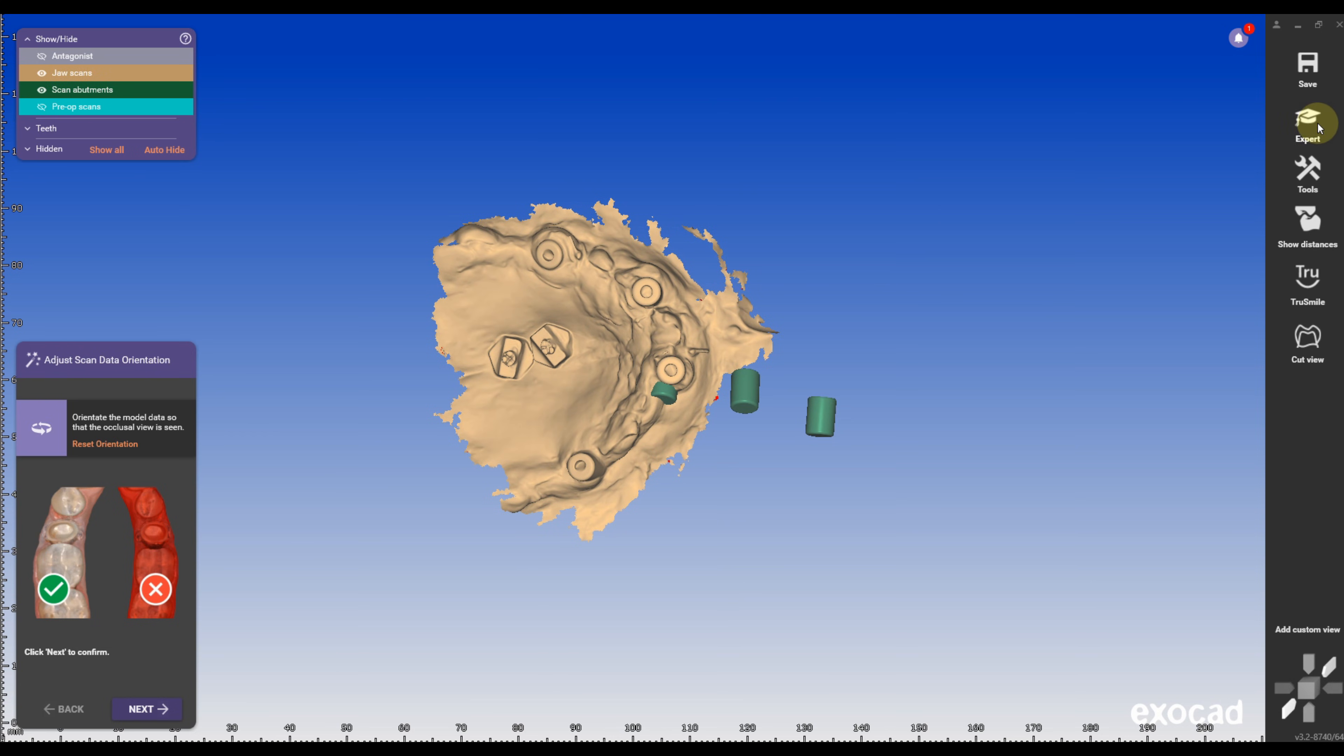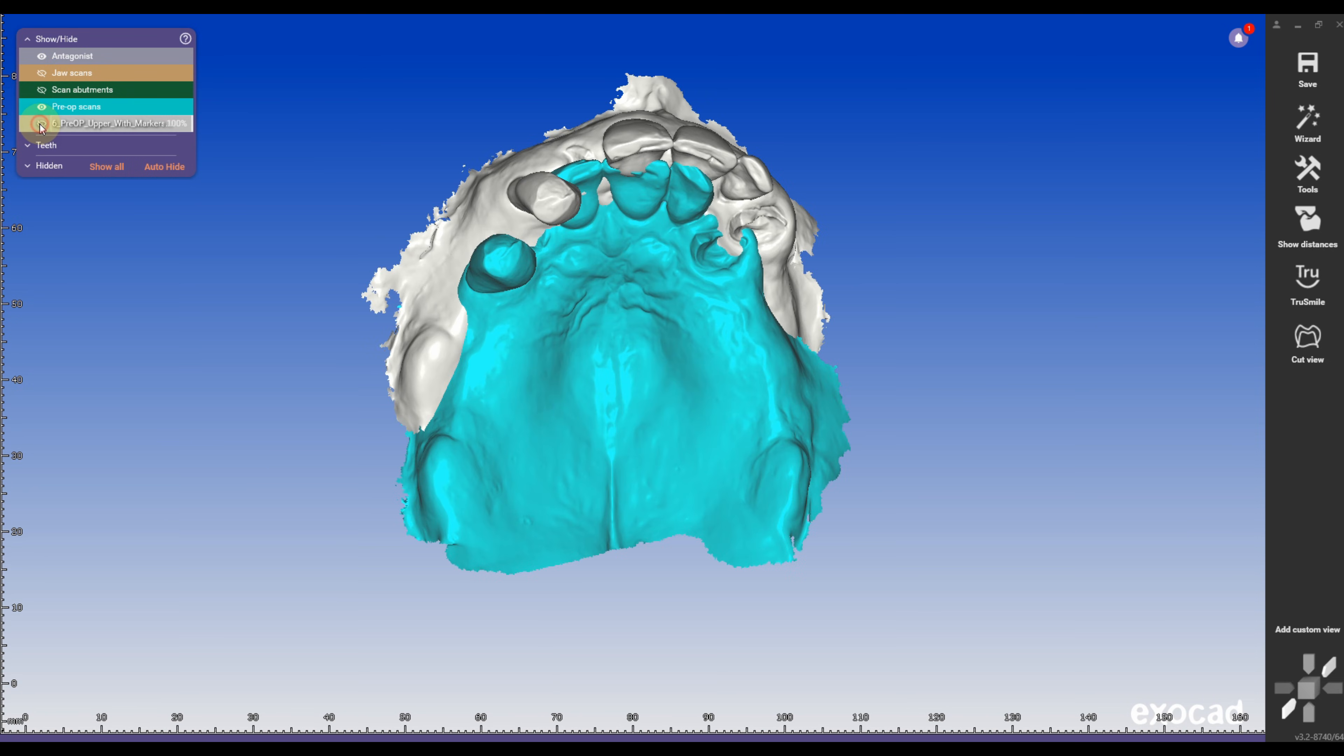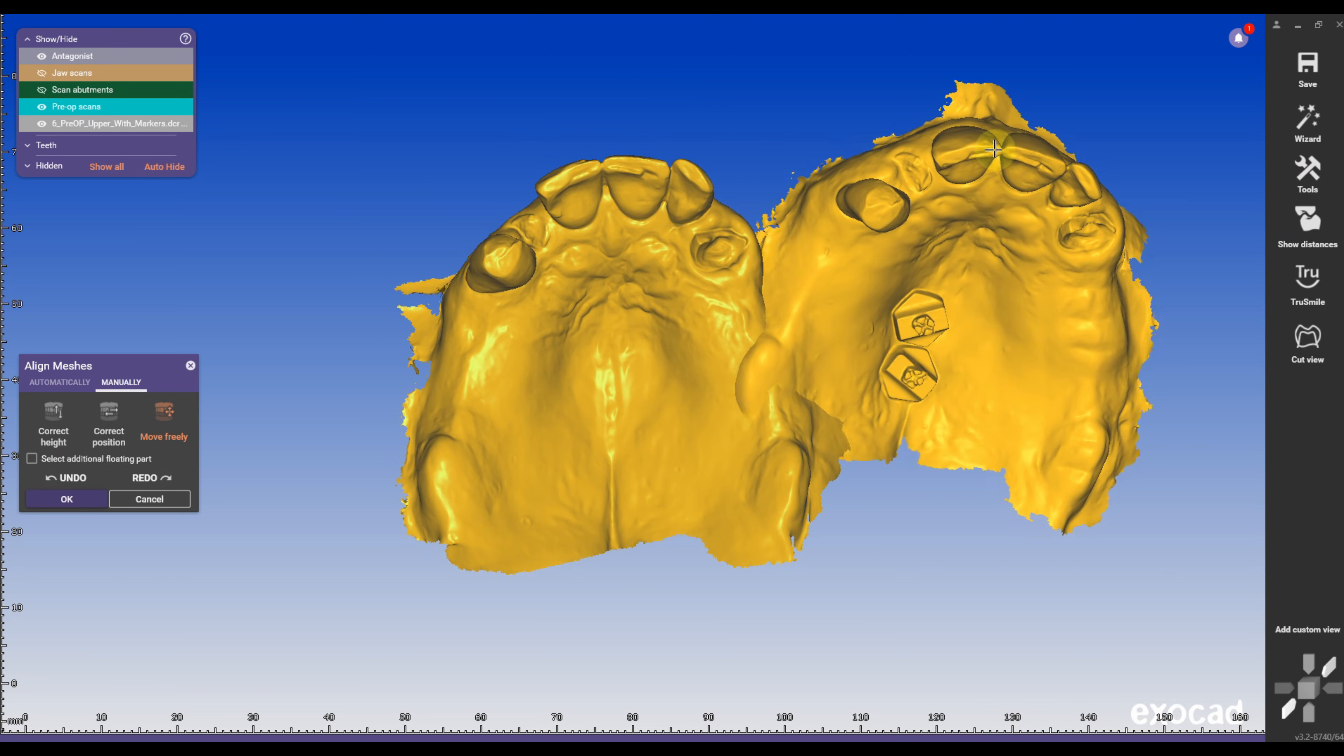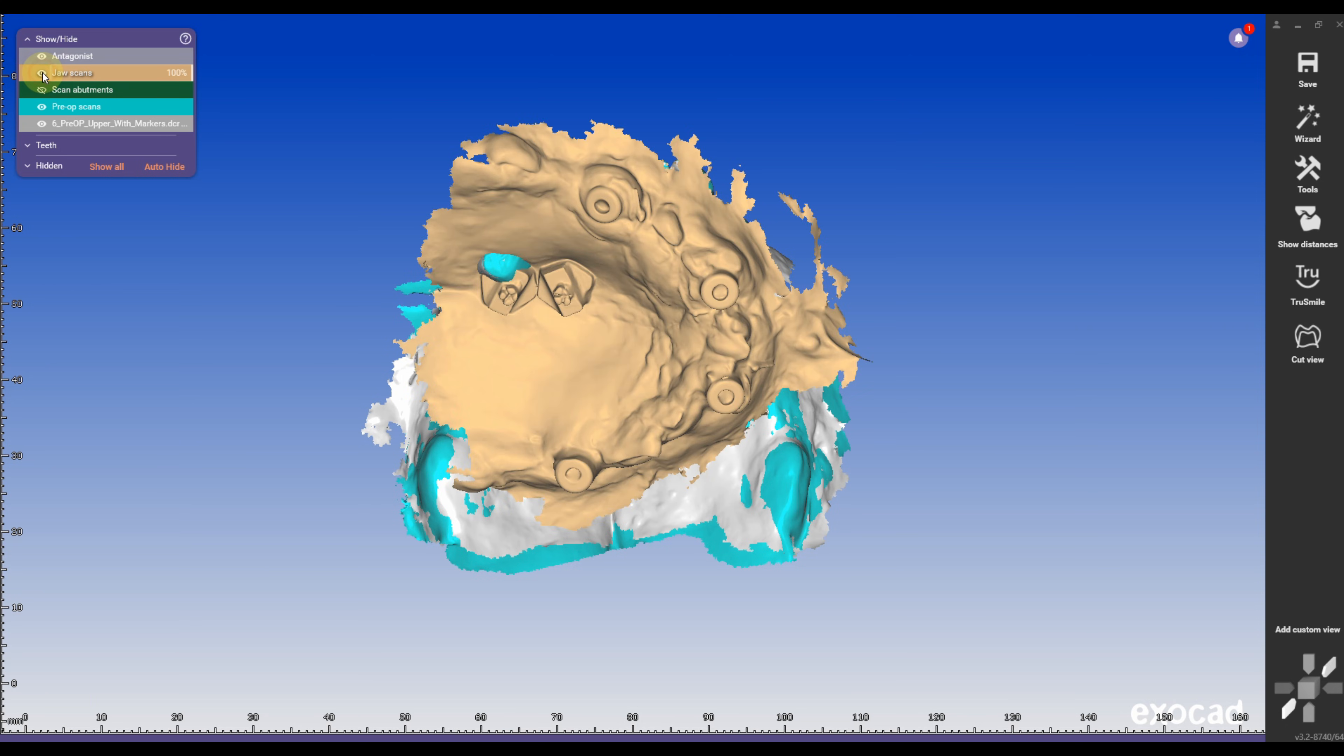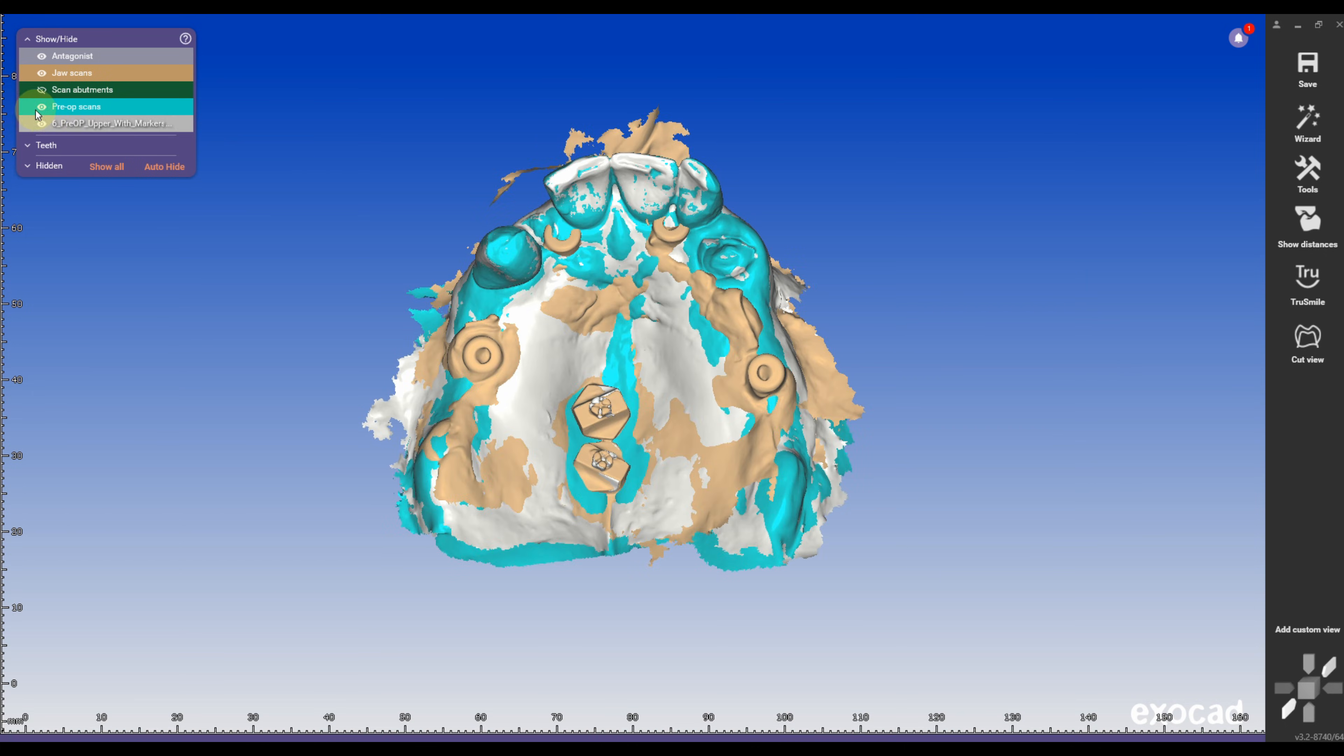The first step is to align all the scans to the one with the occlusal relation to the antagonist. Usually, this is the initial pre-op scan. We start by aligning the pre-op scan, the one with the scan markers in the palate, to the initial pre-op scan, which should be straightforward as it is initially the same situation. Next, we align the post-surgery scan, the one with the markers in the palate, to the pre-op scan. For the lower arch, this can be tricky, so I recommend placing three markers, two in the posterior region and one in the anterior region. I use the scan markers as my primary alignment points.